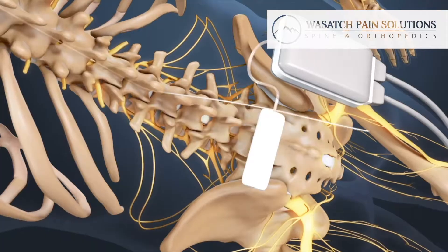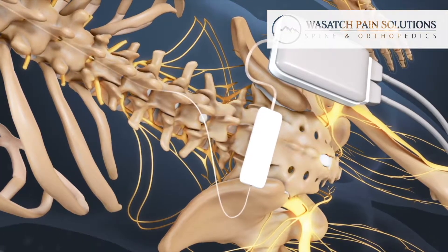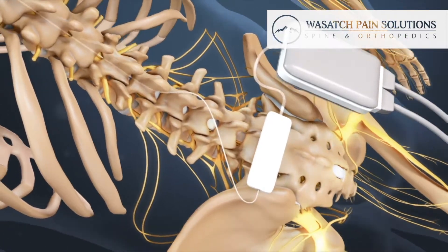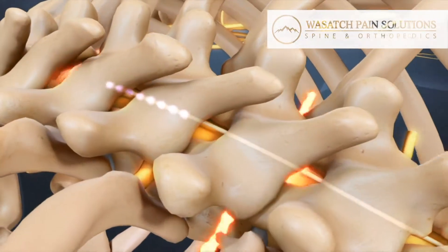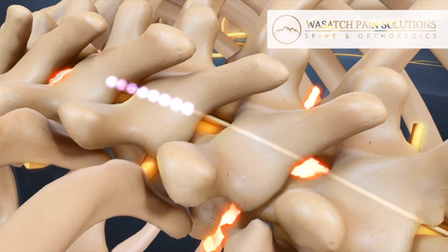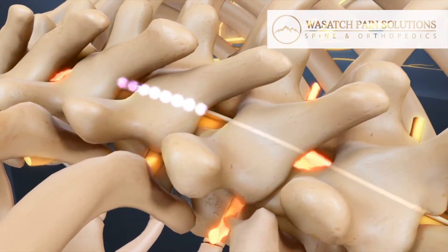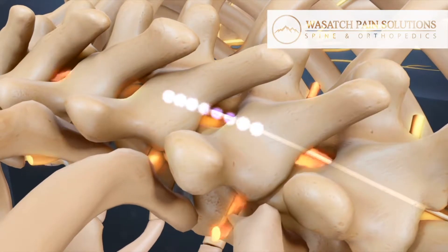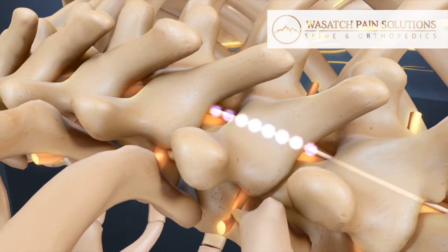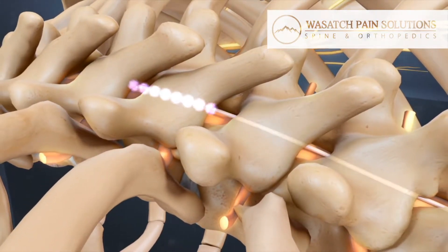Next, the leads are attached to a generator outside the body. The patient is then awakened and asked to give feedback on where additional current is needed for pain control. Adjustments are made by the doctor to ease all the painful areas, and the leads are left in place.